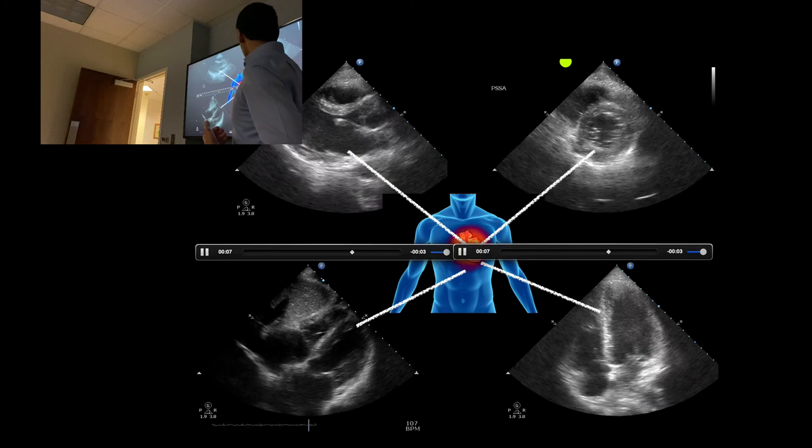Here is a pericardial effusion. The descending thoracic aorta goes behind the heart. If fluid separates the heart from the aorta, it has to be in the pericardial space. You can see how the electrical impulses from the LV get closer and farther from the EKG lead — that's why the amplitudes change. Why does this kill you? The heart relies on being able to expand and contract. When you put pressure outside the myocardium but inside the pericardium, the heart can't change pressure as easily, and you die from hypoperfusion.